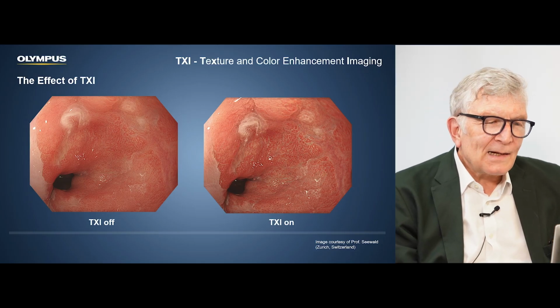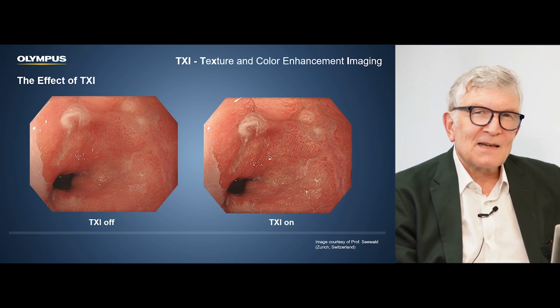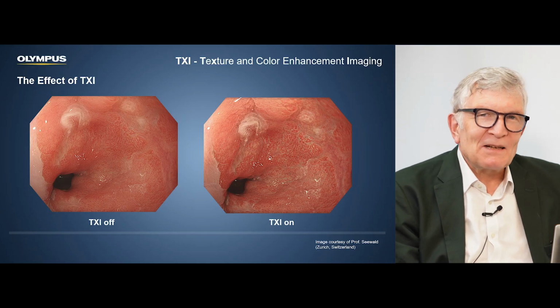Okay, I can tell you the images are pretty similar on that slide, but in reality it's a different picture. And there are fans and people who are hesitant, so it's very, very interesting, and we have to find out what the real benefits are. And again, I think we have to ask Professor Stefan Seewald from Zurich. Stefan, what's TXI and how do you use it?